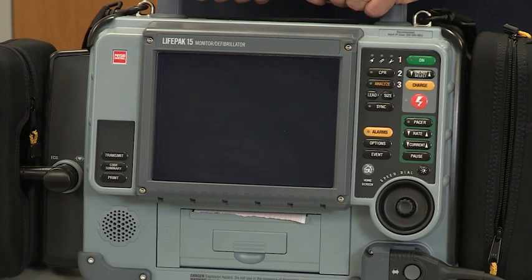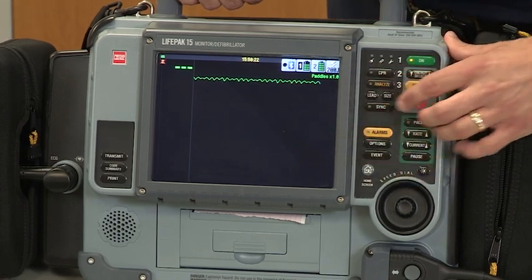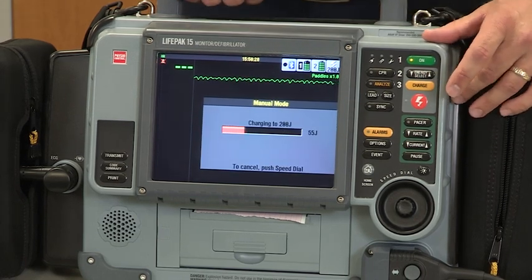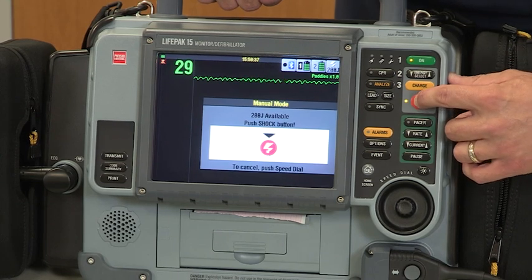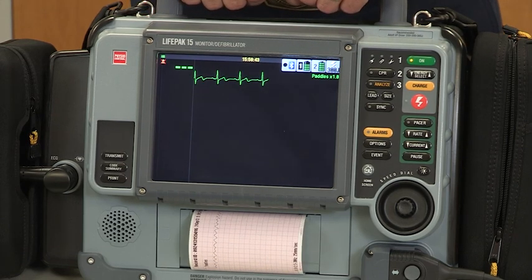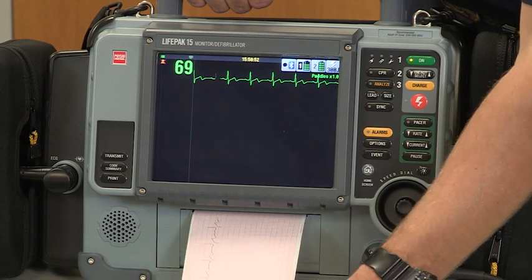Now we're going to review manual defib operations. Turn the machine on. When the machine comes on, it's going to automatically default to the paddles feature. When it's appropriate to do so, per your defib protocol, charge the machine. If you have a shockable rhythm and the patient's clear, go ahead and depress the shock button. Just like the LIFEPAK 12s, the 15s will print out a paper tape of the pre-shock rhythm, the shock, and the post-shock rhythm.